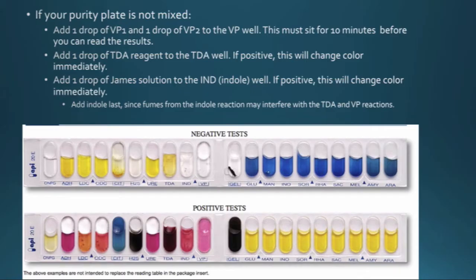If your purity plate isn't mixed, you can start adding reagents. Add one drop of VP1 and one drop of VP2 to the VP well, and this has to sit for 10 minutes before you can read the results. The VP well was one of the ones that yesterday you had filled up the entire cupule — you don't want to overflow the cupule because you still have to put two drops of reagent in there. It probably will overflow a little bit, but it's not a big deal — you'll still get a color change if it's positive.